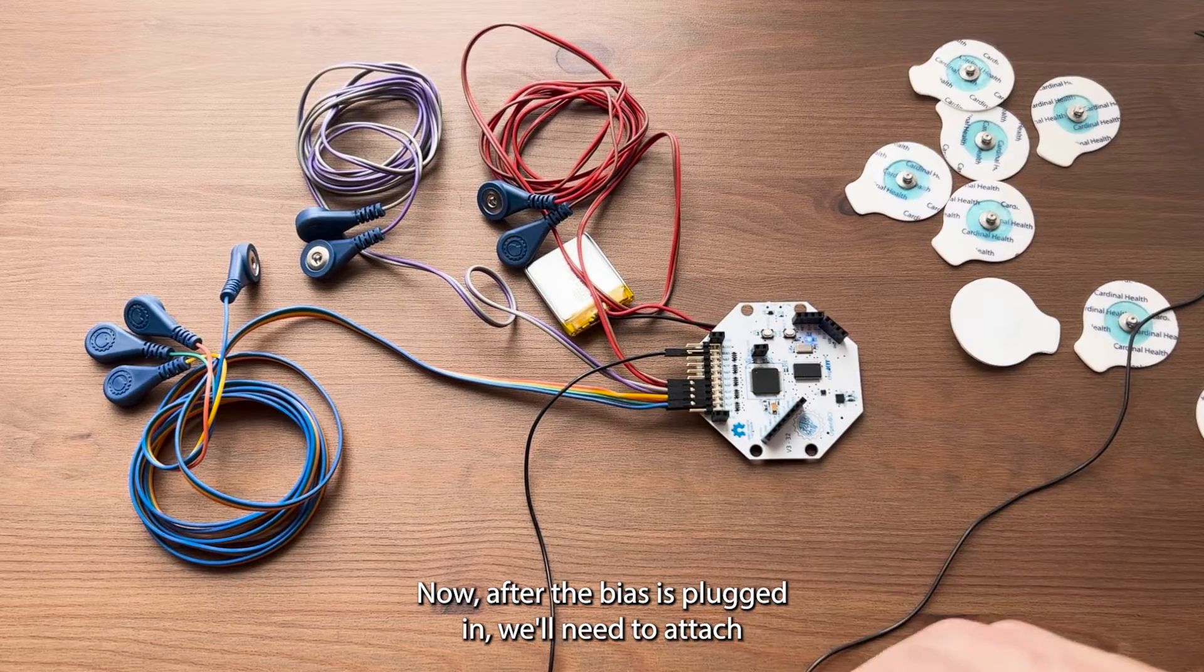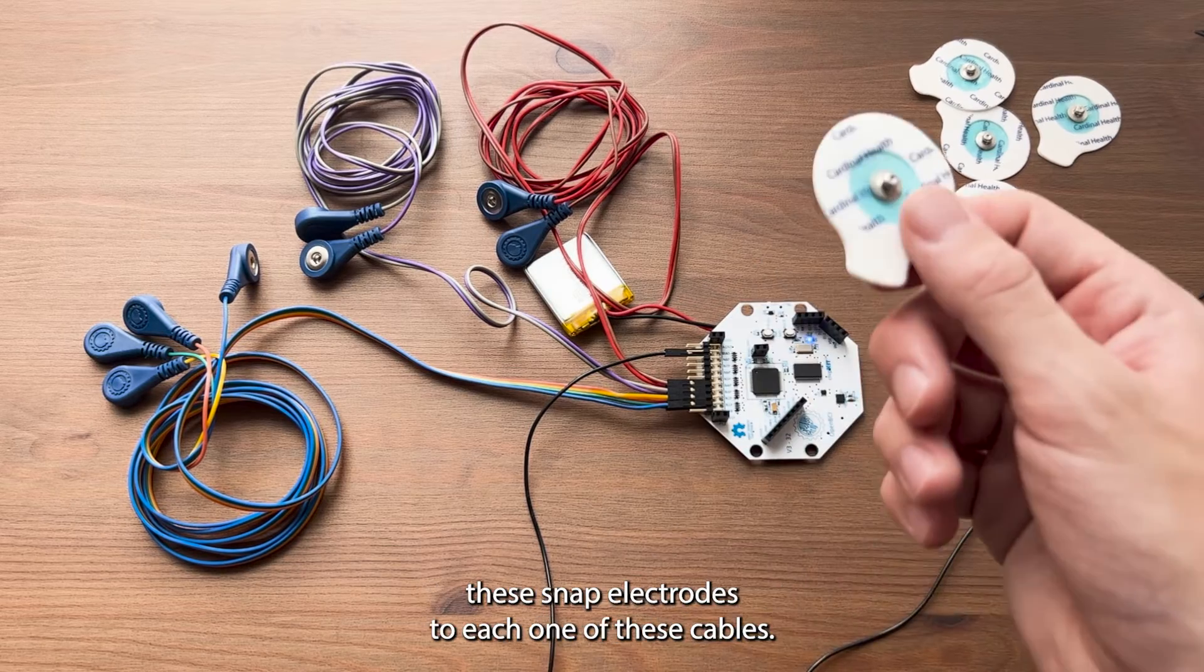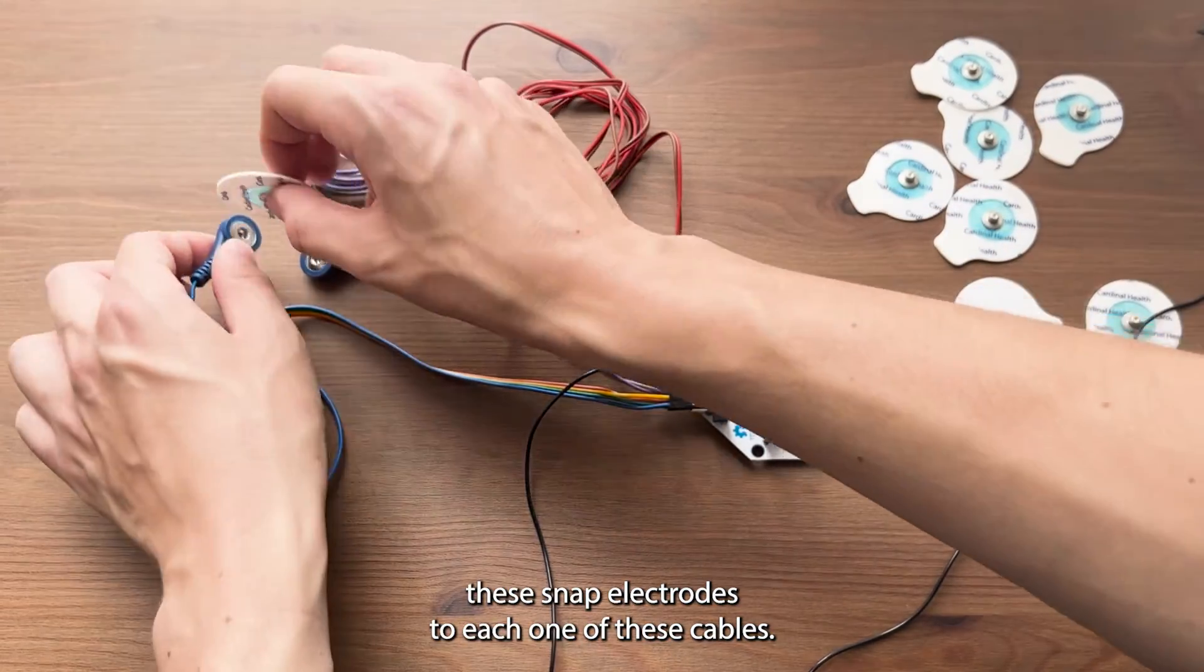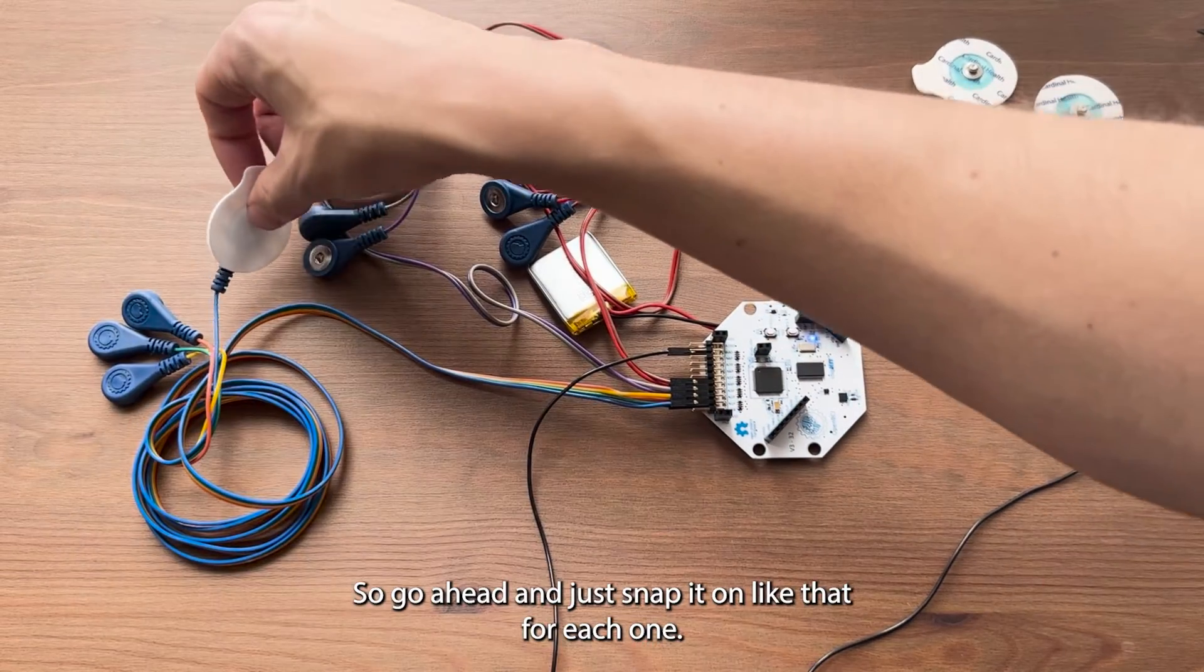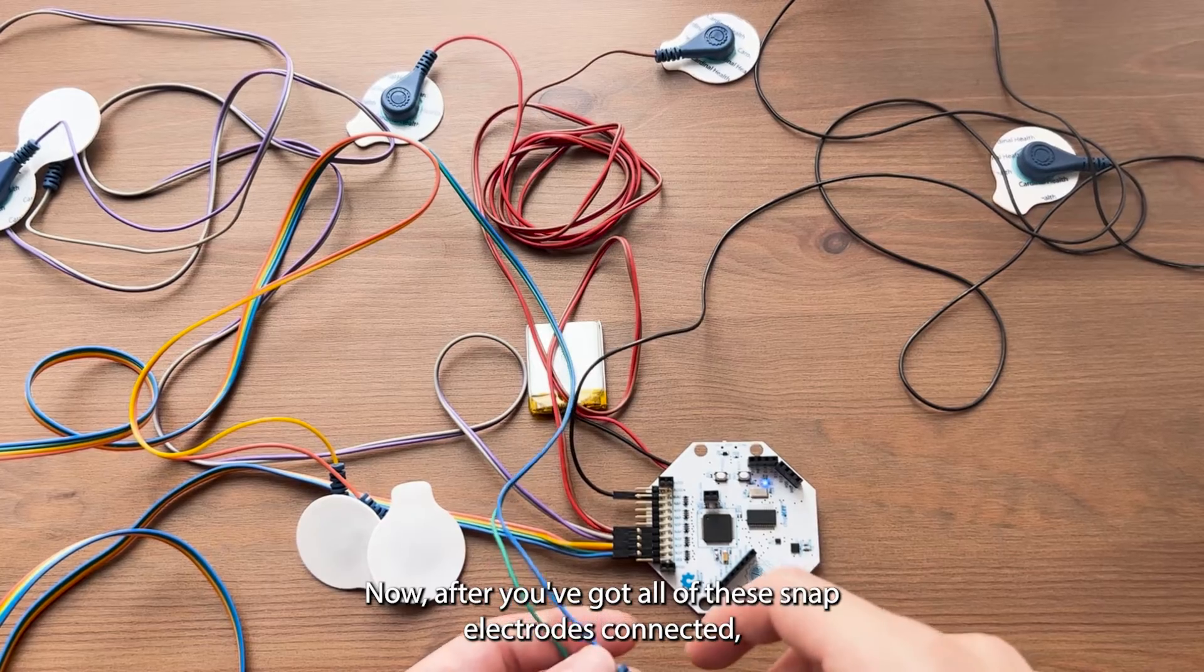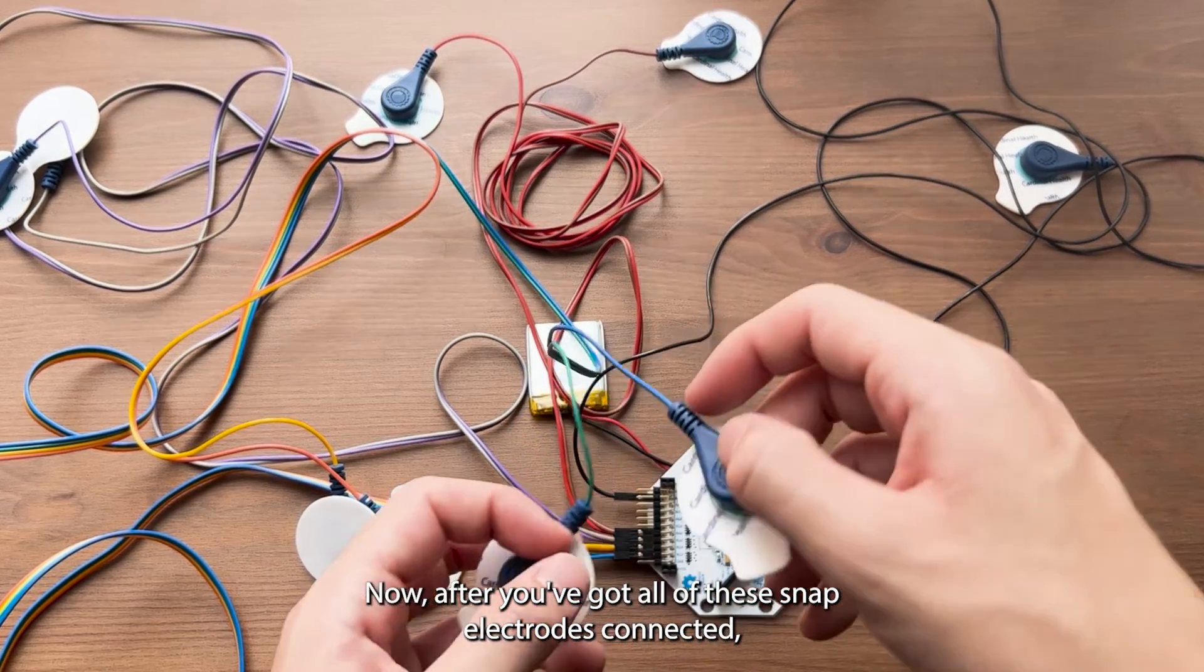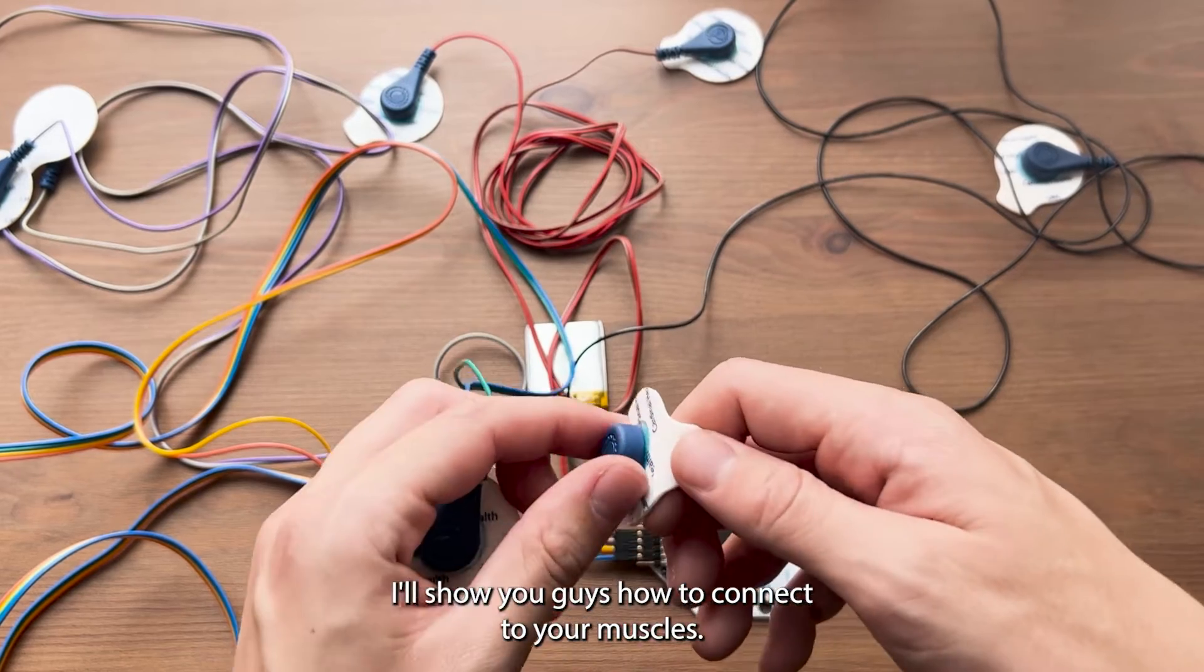After the bias is plugged in, we'll need to attach these snap electrodes to each one of these cables. Go ahead and just snap it on like that for each one. After you've got all of these snap electrodes connected, I'll show you how to connect to your muscles.